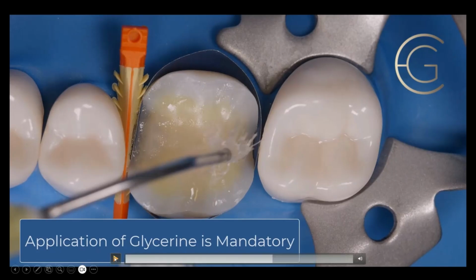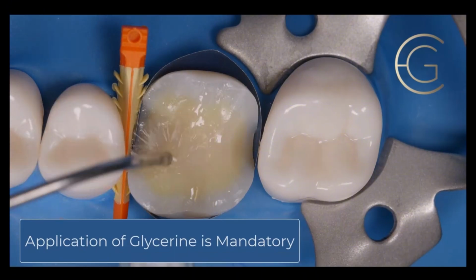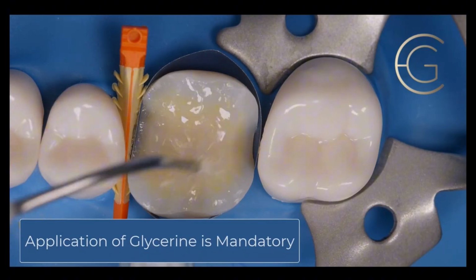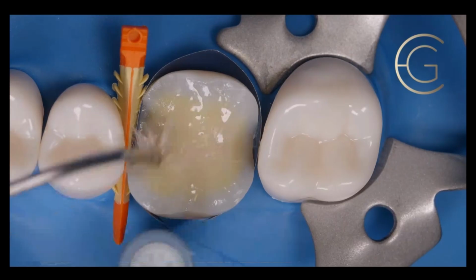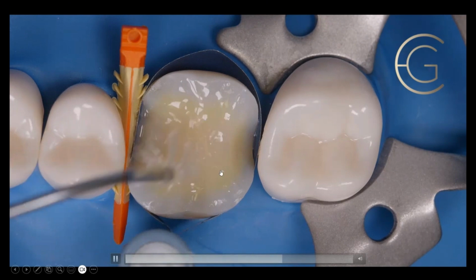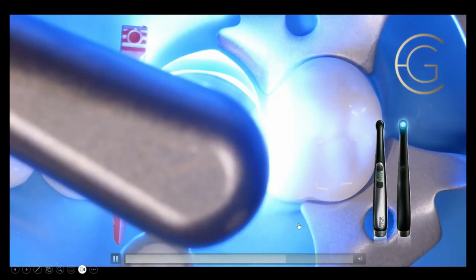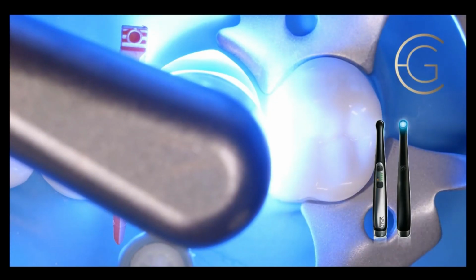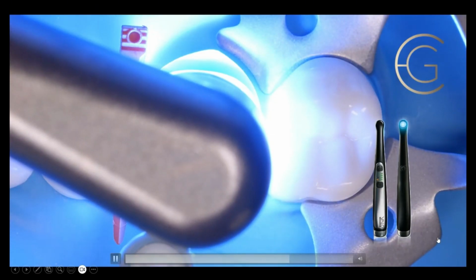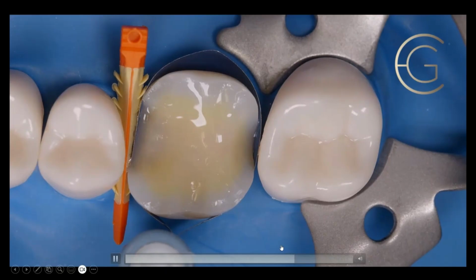All right, so I'm going to apply glycerin, and we're going to move it around, and I'm going to cure this for about 10 seconds. Now, if you have successfully done IDS and resin coating that covers the DEJ, you can use alcohol as well. But if you haven't covered that and you use alcohol on that, you're going to have a lot of trouble with the pulp. So I tend to use glycerin. Okay, so now that's pretty much done at this point.